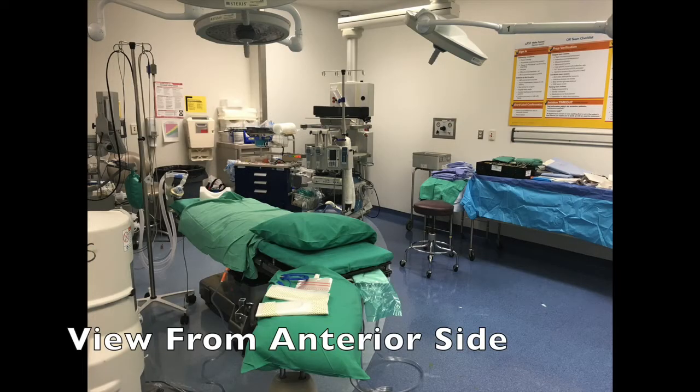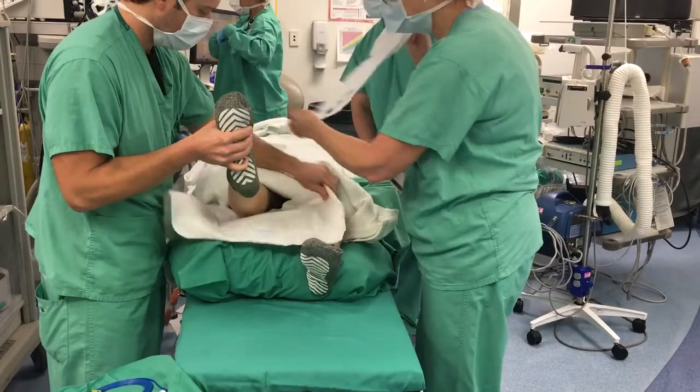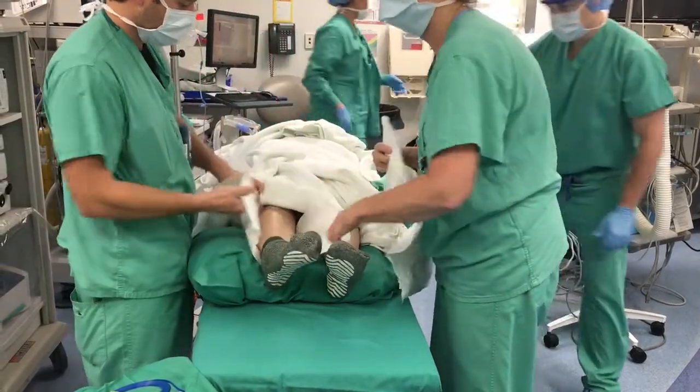General endotracheal anesthesia is conducted in the supine position with the patient's legs resting on a pillow. Sequential compression devices are placed in the lower extremities to prevent deep venous thrombosis during the procedure.